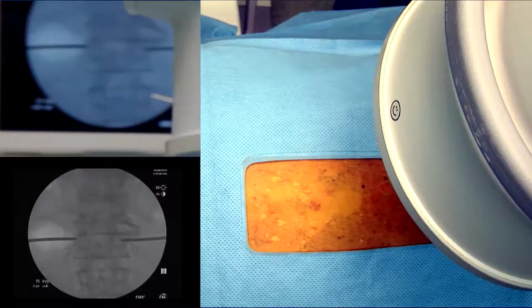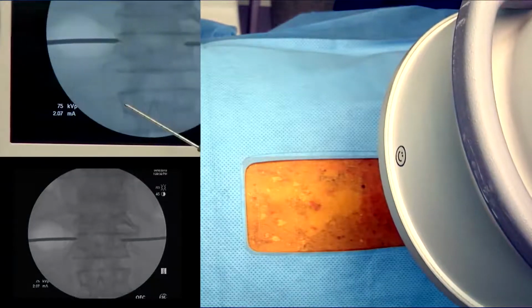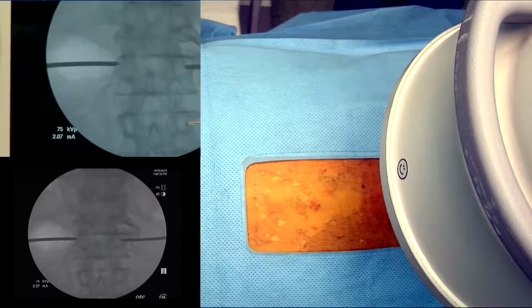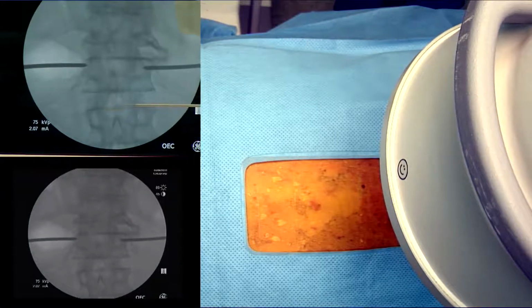Typically, on the right, we'll aim towards the 3 o'clock position, and on the left, towards the 9 o'clock position. And then we'll orient all of our instruments, Jamshidis, guide wires, even pedicle screws, parallel to the superior end plate.